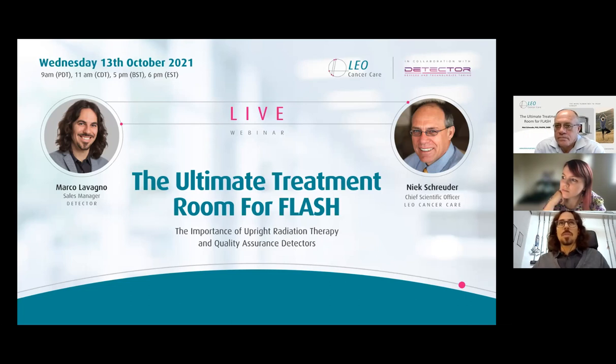Yeah, basically, we have the capability to catch a time structure of around 1 megahertz, so 1 microsecond. So I think that our electronic is capable to do that. We have an electronic without the time, so we have a continuous measurement. If we're talking about 10 microseconds, we can also see the structure inside the beam in terms of time structure for the particle flux, and we are also developing systems for feedback and data transmission to be as fast as possible to react and interface with the control system.